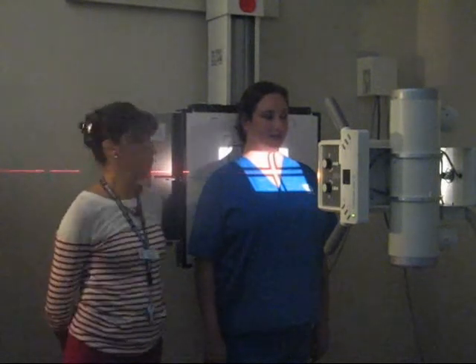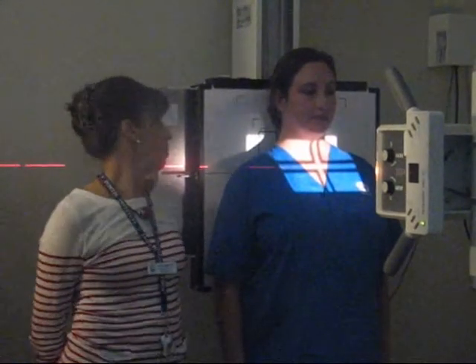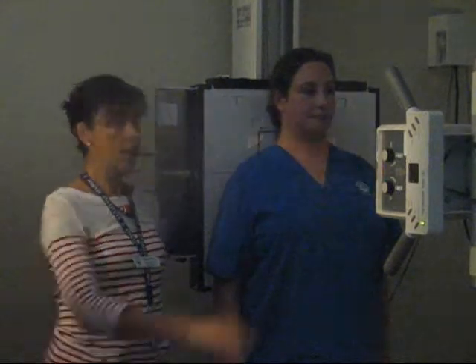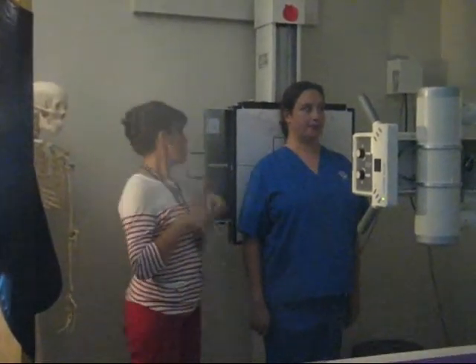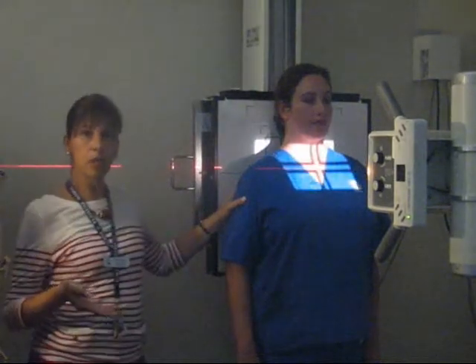The first one is an AP projection, where the patient is going to be standing straight with the back closest to the IR, or the scapula closest to the IR. And what we're going to do is try to bring the scapula out a little so that you can see it better, as away as possible from the lungs and the other body structures. So we're going to set up our CR straight to the middle of the scapula.